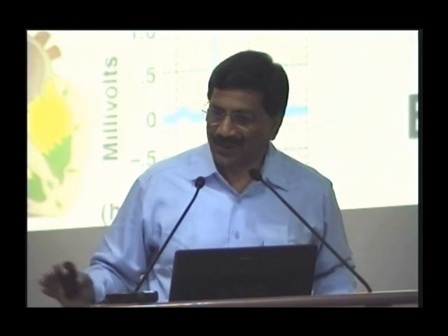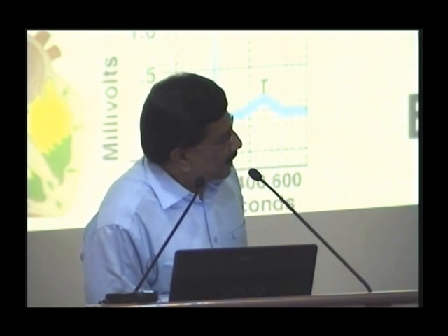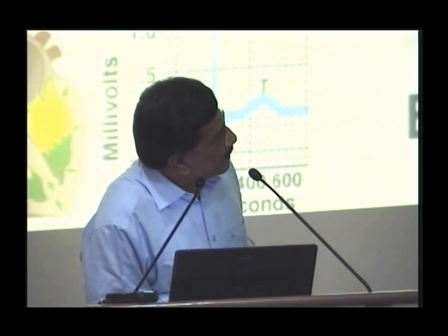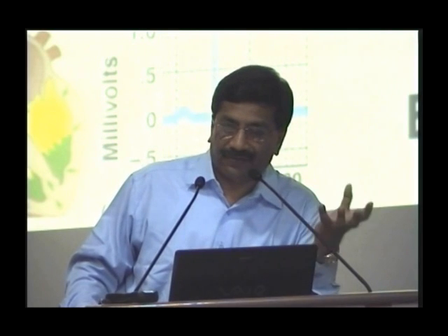And you have three positive waves: P wave, atrial depolarization; QRS complex, ventricular depolarization; T wave, ventricular repolarization. So three waves, three flat lines. That's all the ECG. Finished. Three waves and three flat lines are produced. Once again, at the end of T, the same cycle begins from the atrial depolarization and so on. So this is how your ECG is derived from the basic cardiac cell physiology, how it translates into the ECG recording on the ECG paper.